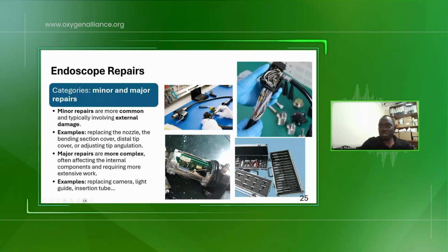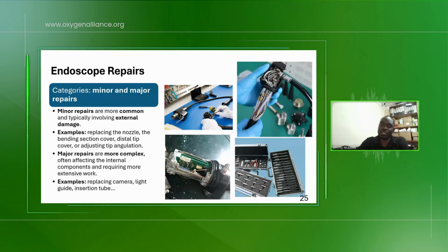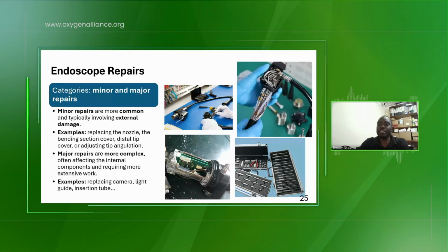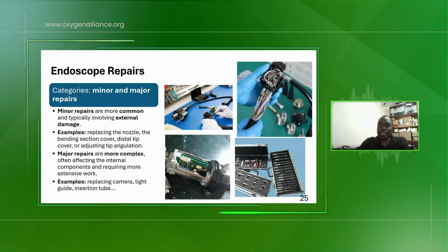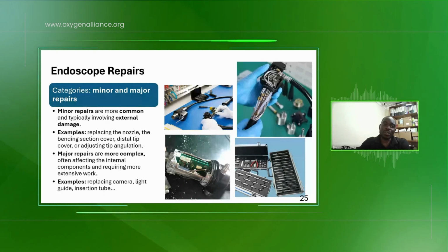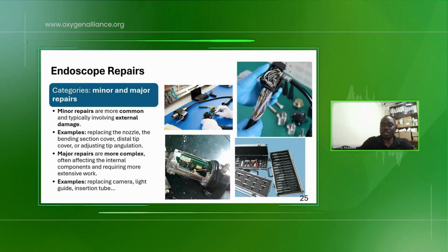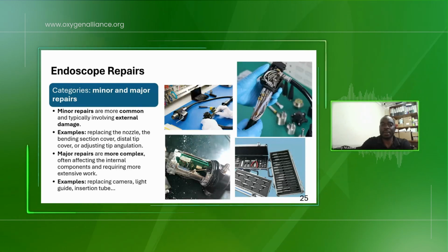It uses specialized tools, by the way, to do the repairs for scopes. So it's not like you pick a screwdriver and start opening the scope. Scopes have different jigs and different tools you use to open them, and they differ depending on the brand of the scope. That's why even setting up the workshop itself is expensive. But if you handle the scope very well, you won't find major issues with repair, and therefore you won't have many issues with repairs or downtime.